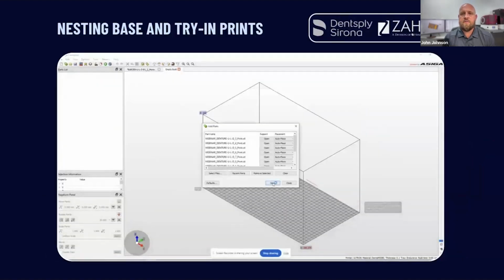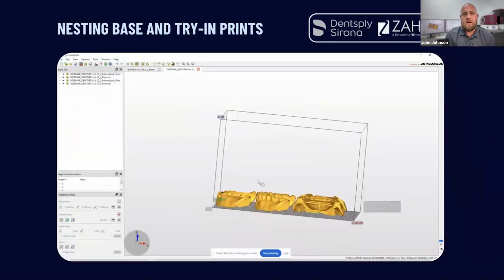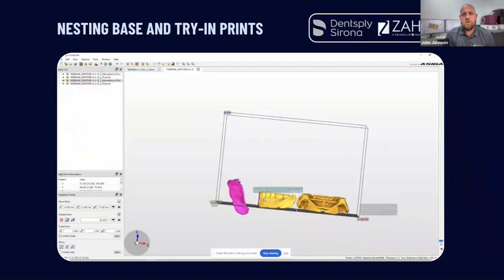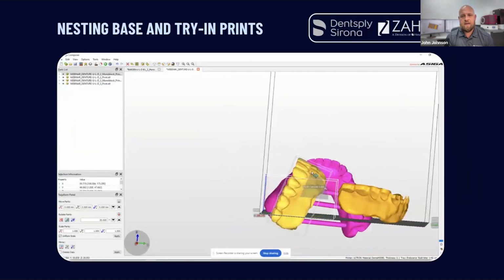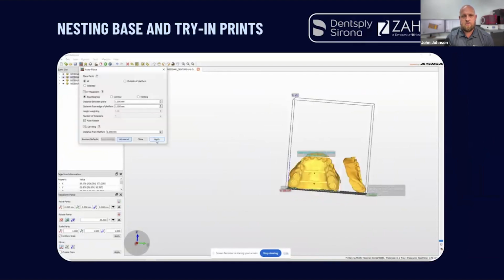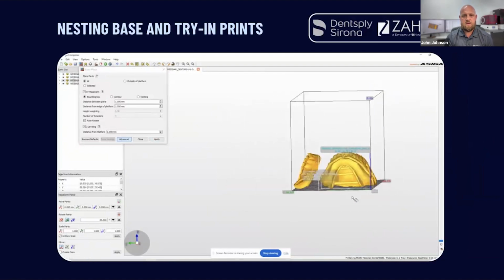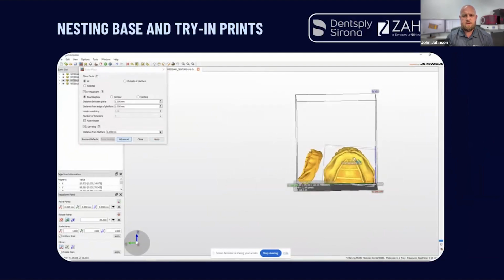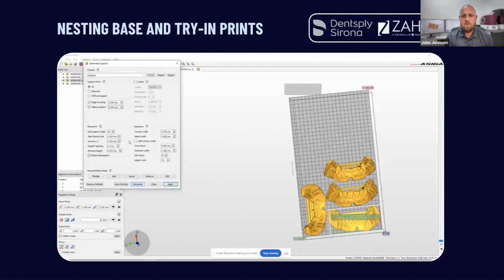So this is another thing that you've got to learn. This is the nesting. Like I said, I'm an Asiga user, so I'm showing you how I nest these products. Now, I like to do all of mine vertically. When I first got trained, when I first opened up, everything was done kind of on its face, on the facial aspect of the denture. But there was just so much finishing that you needed to do because you had all the supports that would go on the facial aspect of my denture.